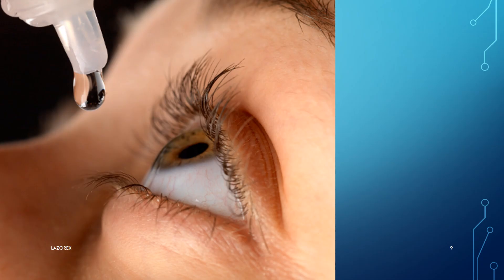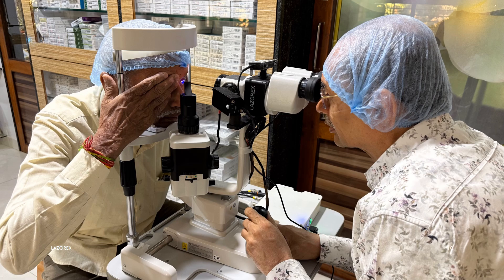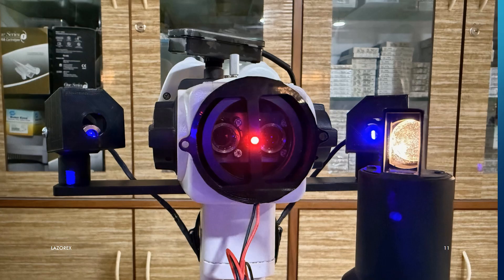After numbing the conjunctiva with proparacaine eye drops, the patient is taken on the slit lamp and the head is best aligned. With the other eye closed, the patient is asked to fixate on the central red target light, which also gives a red Purkinje 1 image on the cornea, denoting the actual and real position of the visual axis in the pupillary area of the cornea.